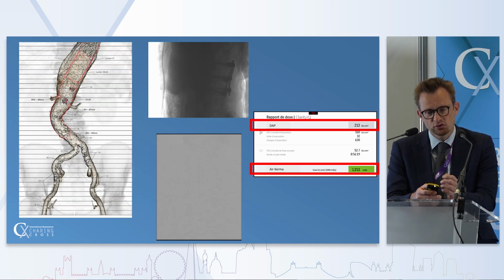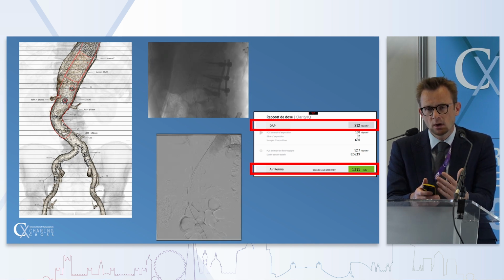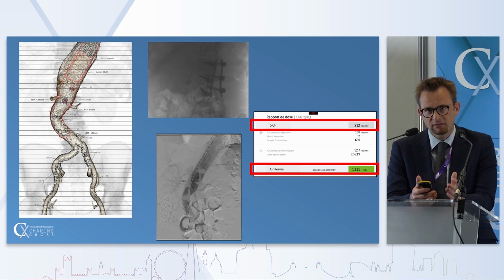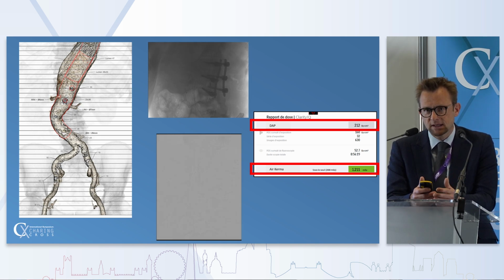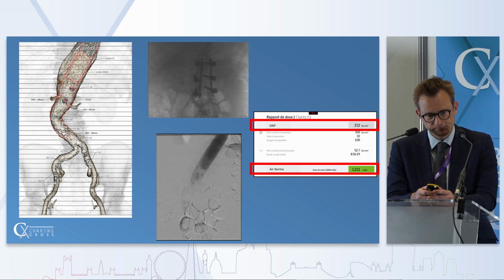And when it comes to treating the thoracoabdominal segment, as you can see here, there is even more radiation, specifically in obese patients and in patients having metal implants in the body. At the end, the level of radiation is again quite significant for both the patient and the medical staff.